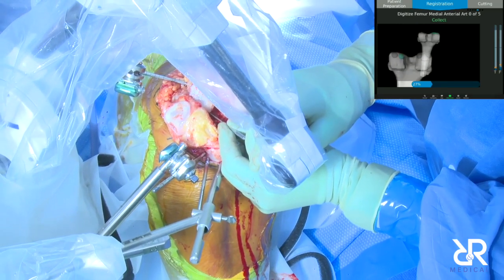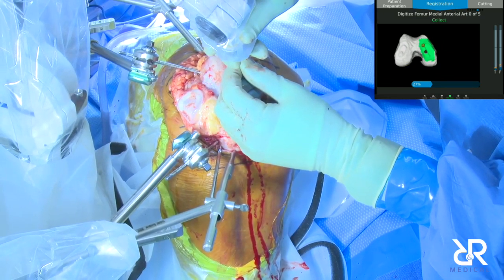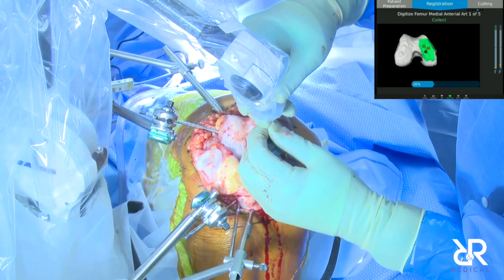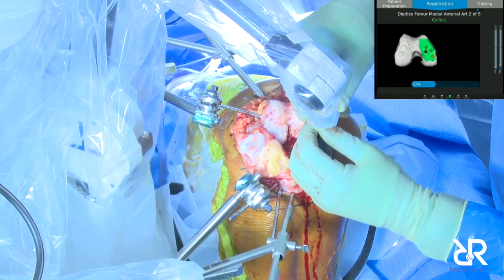If you're matching a CT scan, discrete points are fine. If you don't have a CT scan like the Navio, you have to paint, because the more data points, the better, right? The more likely you get a good model.